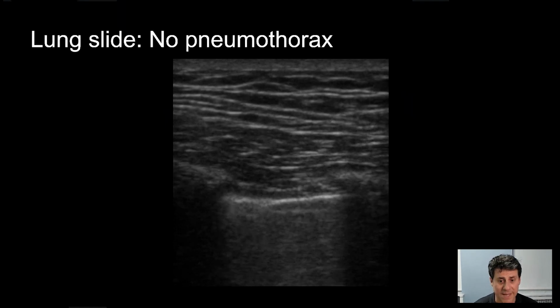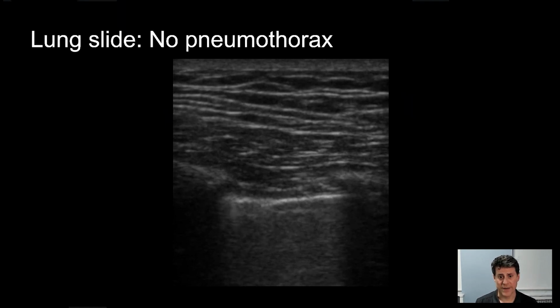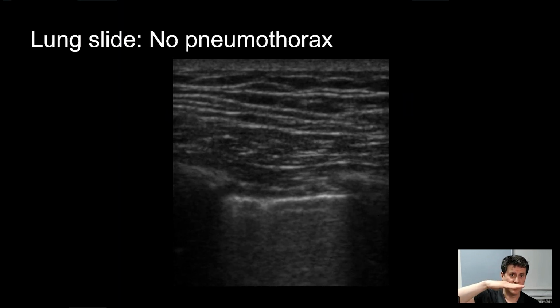And you see how as it slides back and forth as the patient breathes, we're ruling out pneumothorax. Parietal pleura is more superficial. It is the surrounding pleura of the chest wall itself, and then just deep to that, immediately adjacent to it and rubbing right up against it, is the visceral pleura.